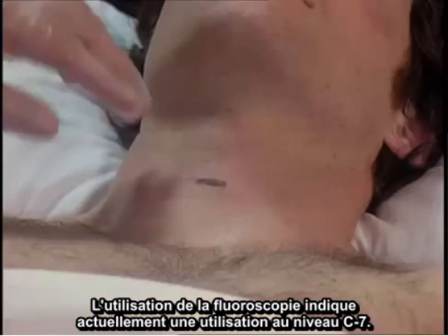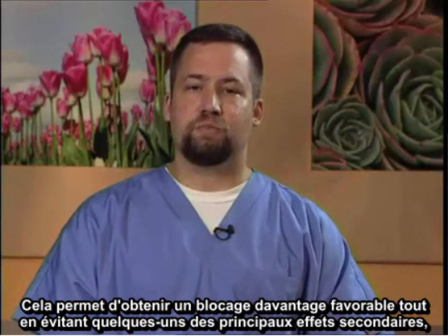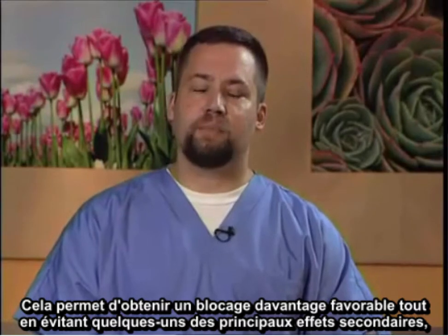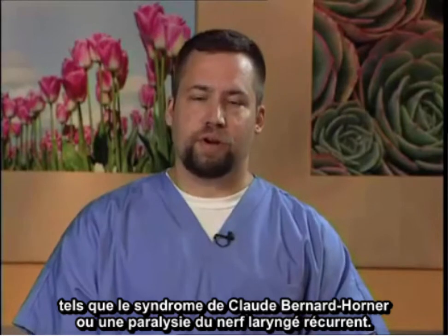Currently, the use of fluoroscopy indicates use at the C7 level. The reason for this is to provide better sympathetic blockade while avoiding some of the common side effects such as Horner syndrome as well as recurrent laryngeal nerve paralysis.